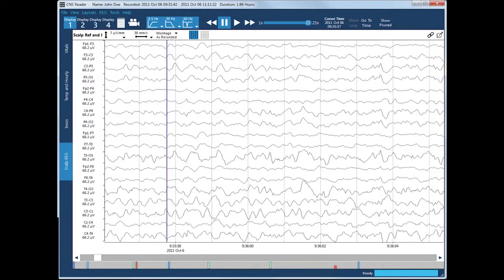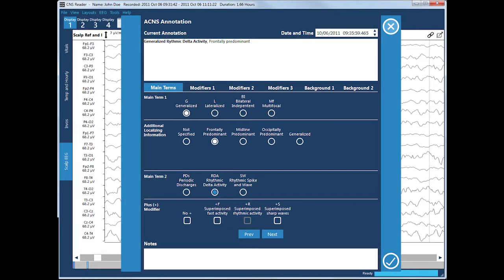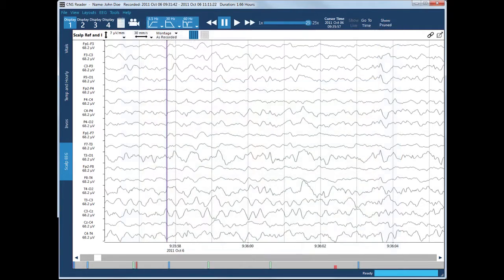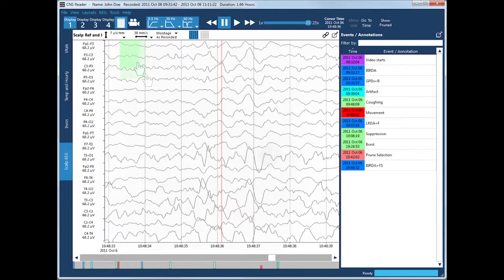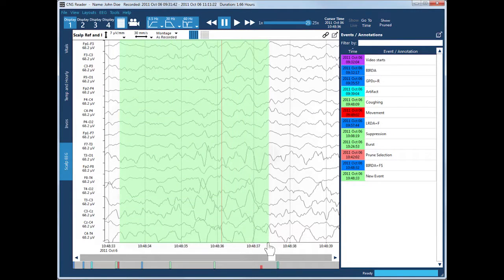Quickly review EEG waveforms and add annotations based on standard ACNS terminologies simply by pressing a button. Annotations can be entered at a point in time or for a duration of time.